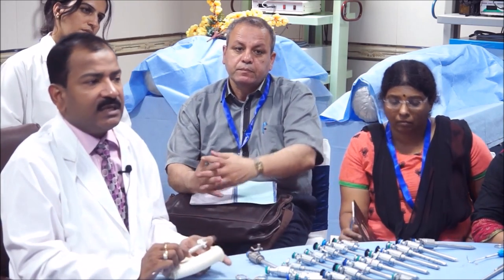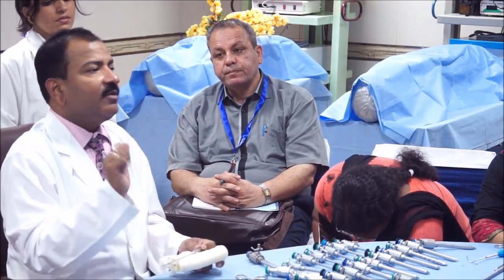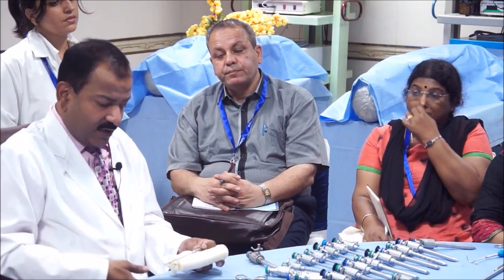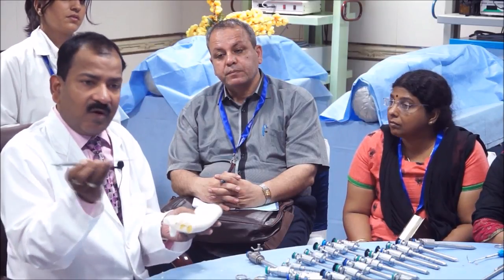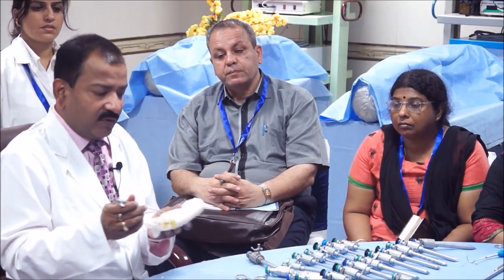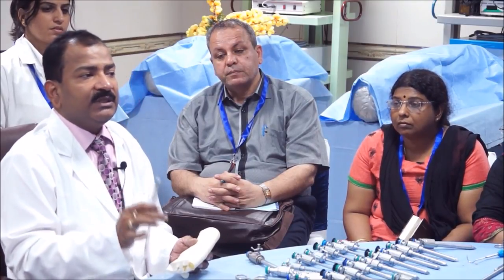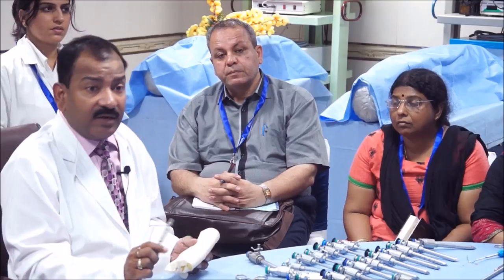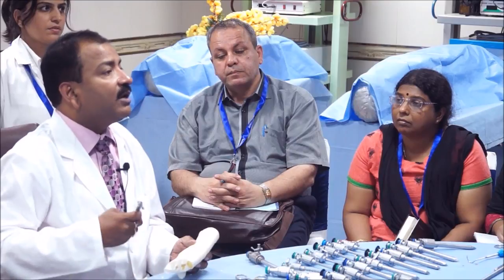You know what happens sometimes, there are three exceptions to the oblique insertion. One is the morbidly obese patient, another is any lower midline incision, and third is diagnostic laparoscopy under local anesthesia. Suppose the patient is morbidly obese, BMI 40 and all, then you do not have to go oblique, you must go perpendicular. Because in a morbidly obese patient, if you go oblique, you will be lost somewhere in the fat pad, the pre-peritoneum. And in a morbidly obese patient, we go transumbilical if you are a gynecologist. And if you are a surgeon, sometimes in a morbidly obese patient, you have to go supraumbilical.